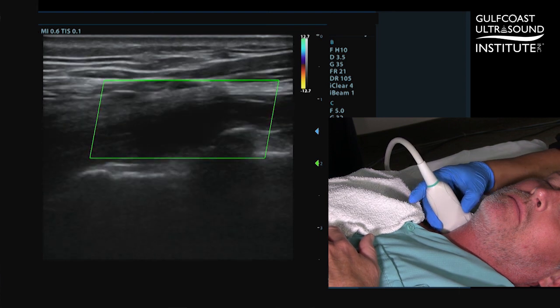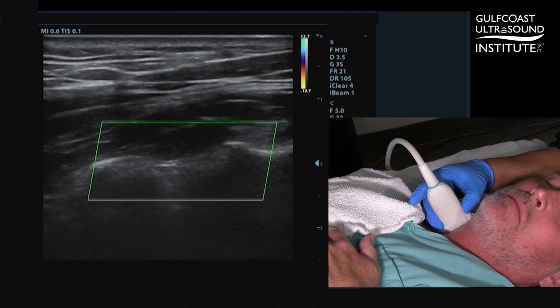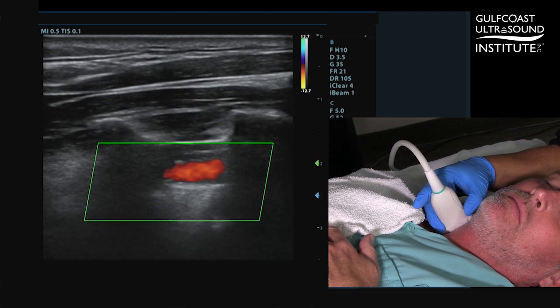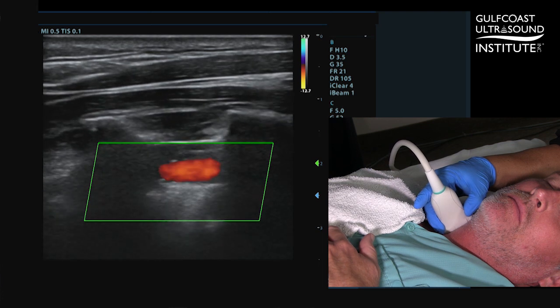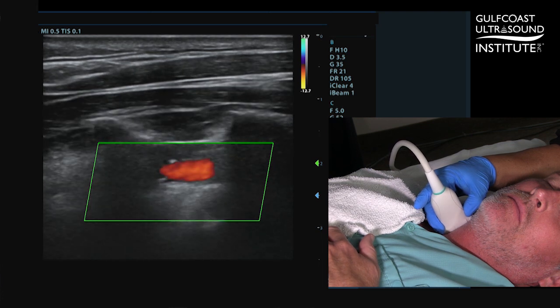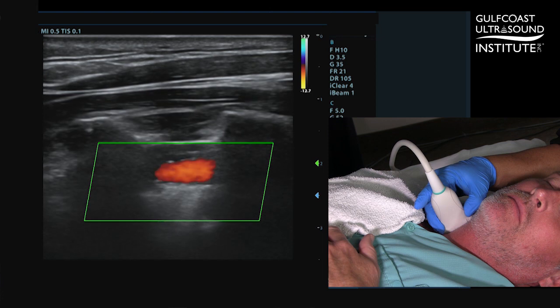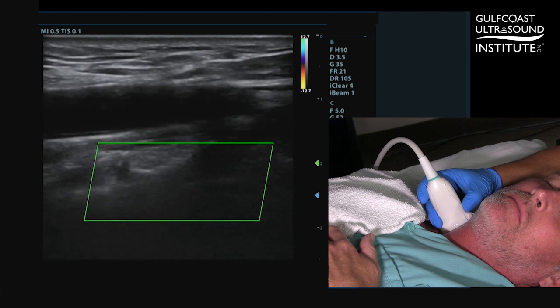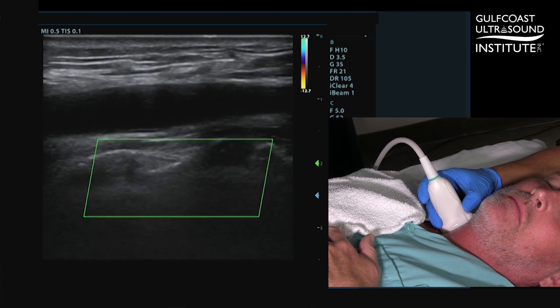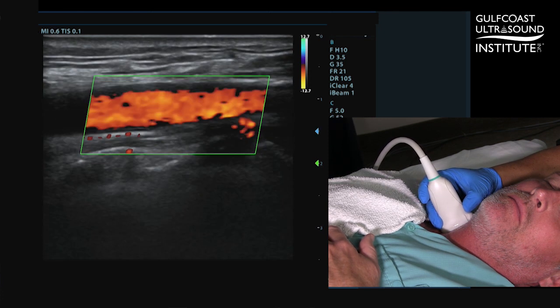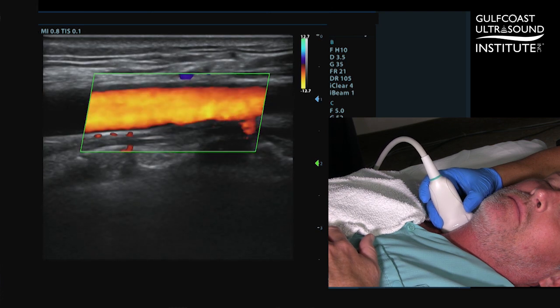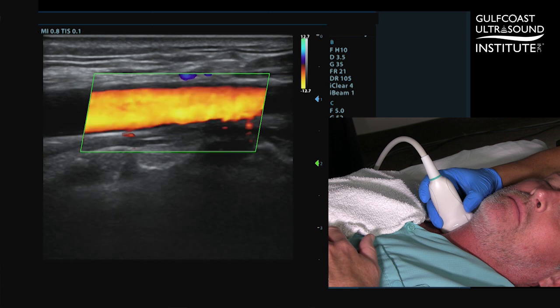Once again, angling posteriorly through the transverse foramina to double-check into the cervical spine. You see the transverse foramina and the cervical spine on both sides as the vertebral artery courses through. Then angling anteriorly back towards the common carotid artery and moving the color box over it to show that the colors are in fact the same, confirming antegrade or forward flow towards the brain.